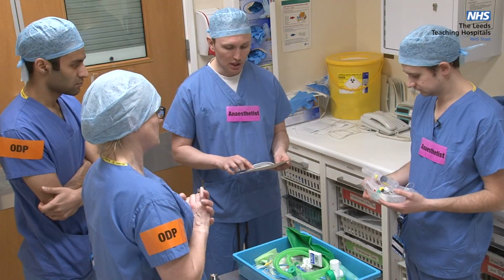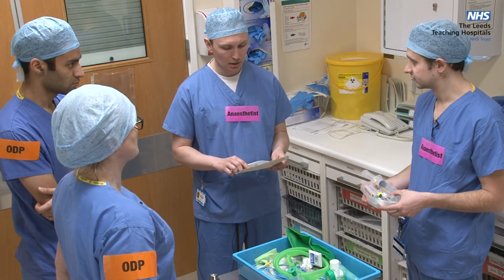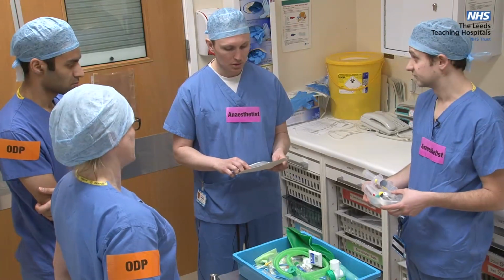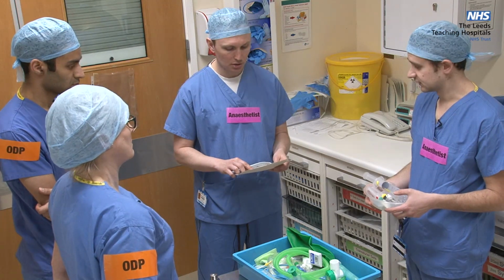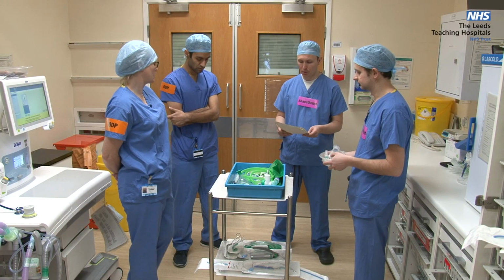And then we're just going to run through the drugs with you, Paul, if that's okay. Yes. So, induction agent. Yes, I've got some ketamine. Muscle relaxant. Yes, I've got rocuronium. Vasopressor. Yes, I've got metaraminol. Saline flush x2. Yes. Maintenance sedation. Yes. Fine.